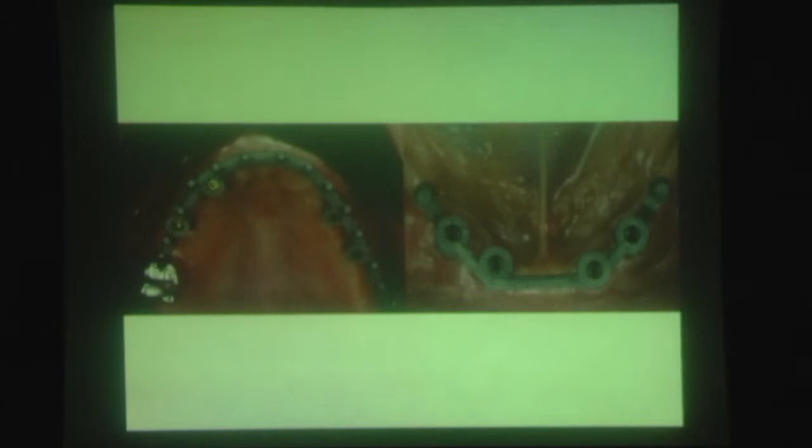Sometimes we put some titanium pins inside the mouth, and we try to match. Sometimes we use gutta-percha. You know gutta-percha? You use it in endodontics? Perfect. Sometimes we dig holes and put some gutta-percha because, in the tomography or in the OPG, we can see it clearly. Sometimes we put some metal balls.